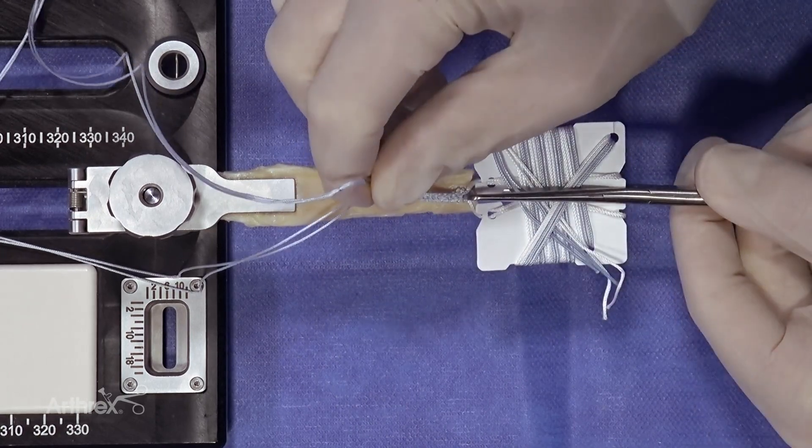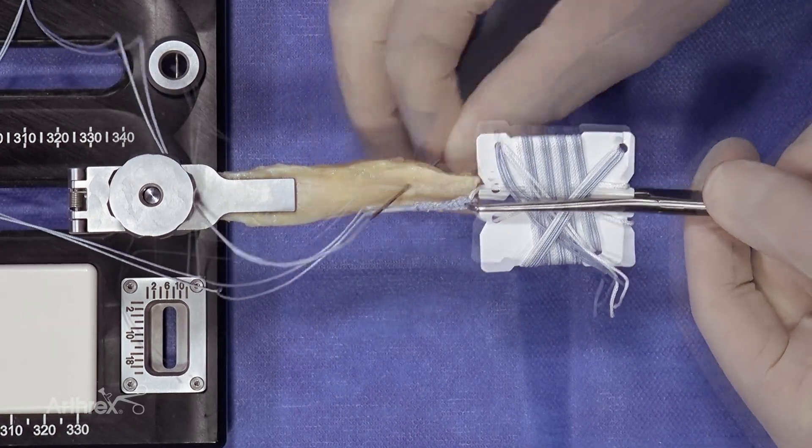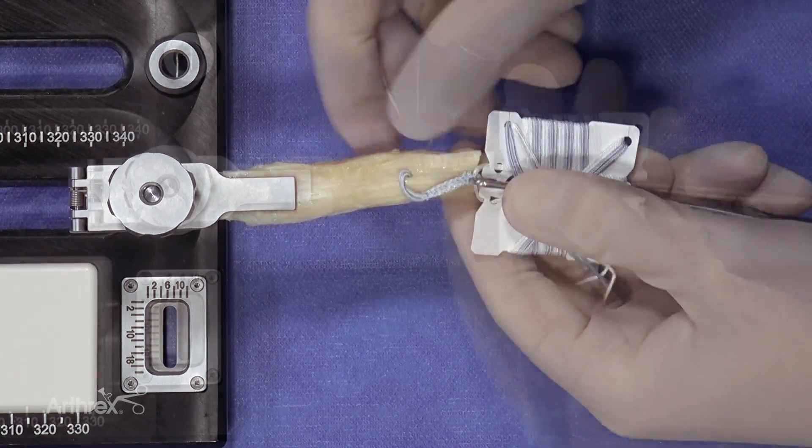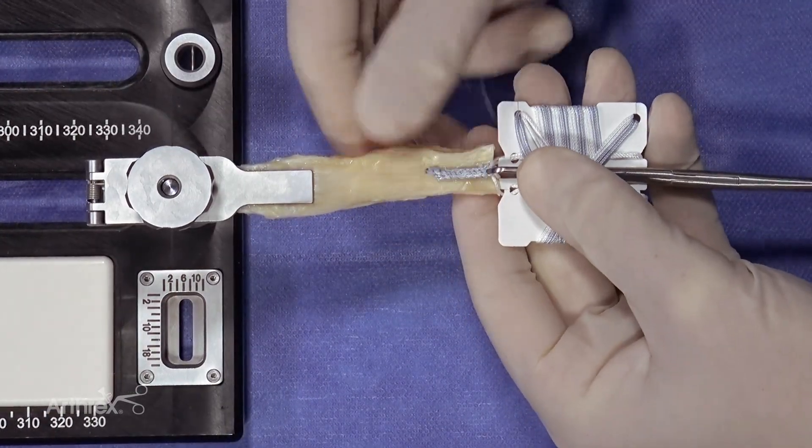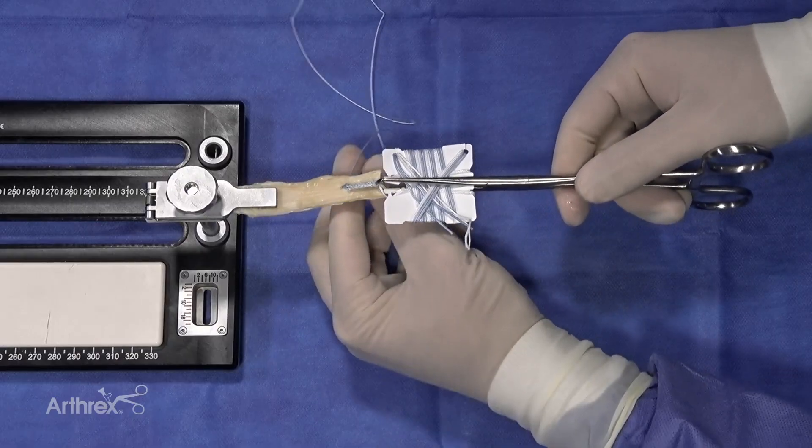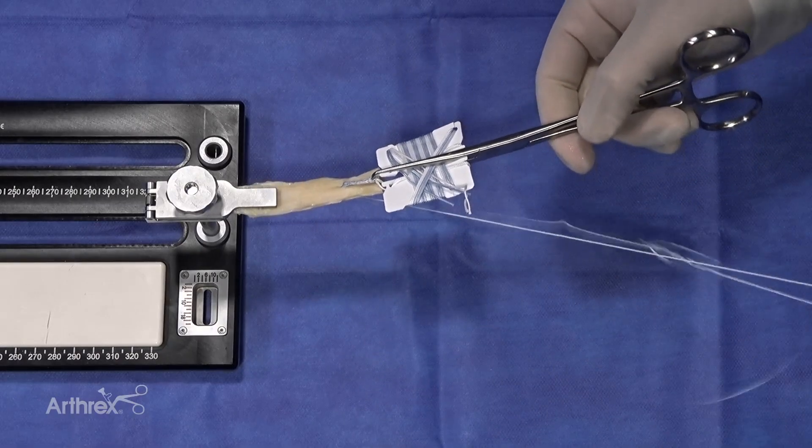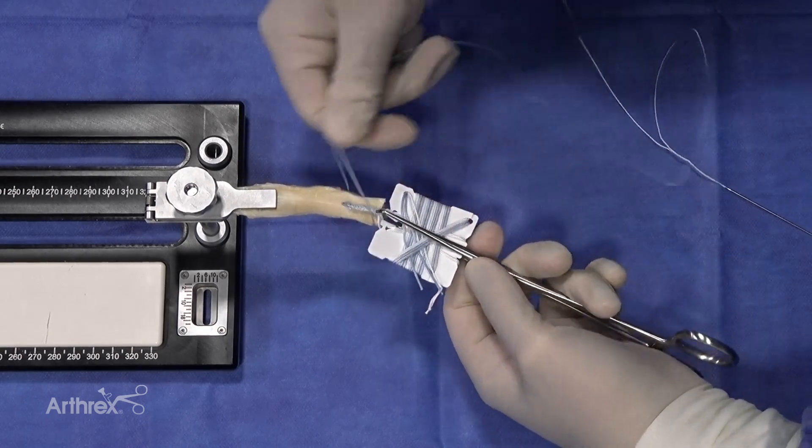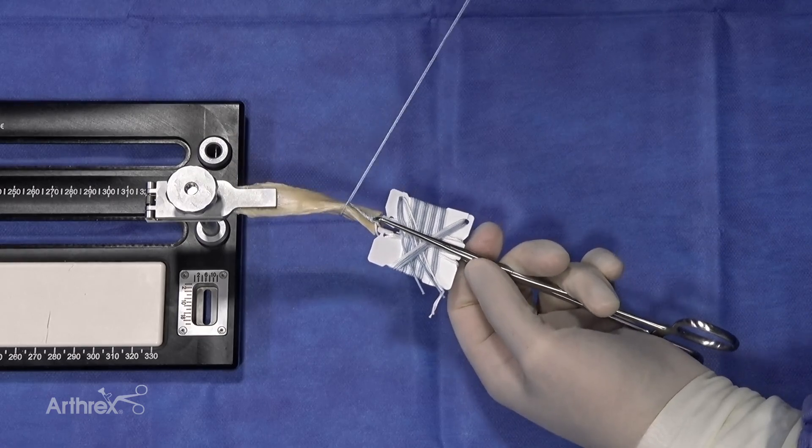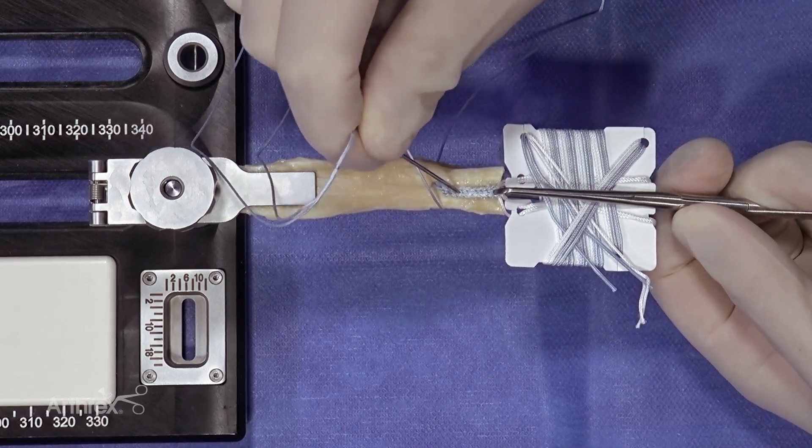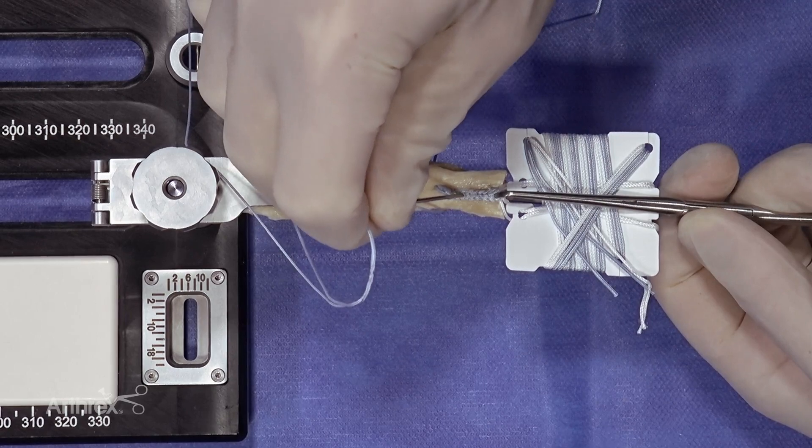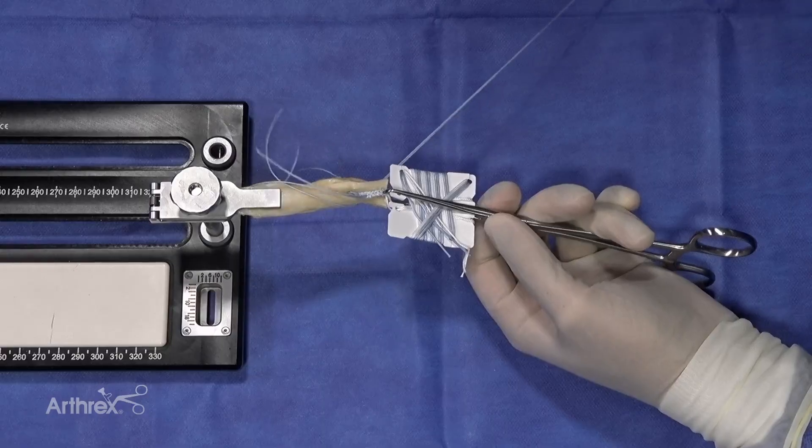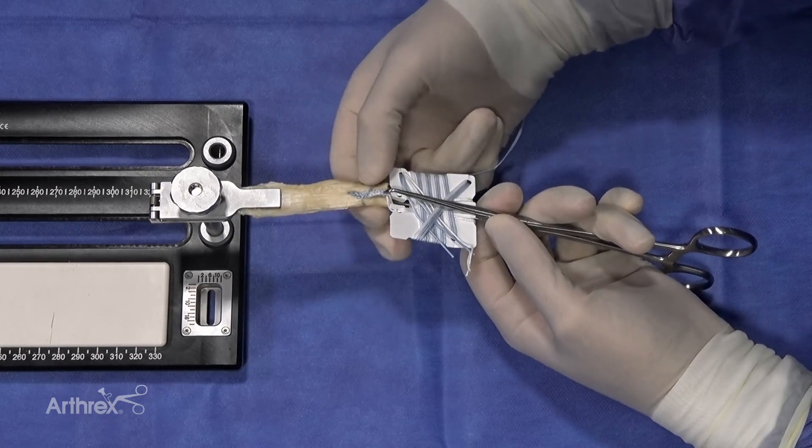The fiber tag portion of the implant is between 18 and 20 millimeters in length. Notice that when we pull these sutures, we pull them together so we don't split the graft. Then we loop around, holding tension. This could be easier if you have someone else to help, but it could be easily done by yourself. Then we go about almost halfway up the graft, pierce the fiber tag, and this causes a rip lock type system. Watch here, we'll pull with two hands on this and that'll tighten it down.